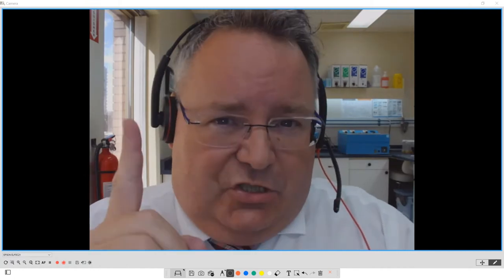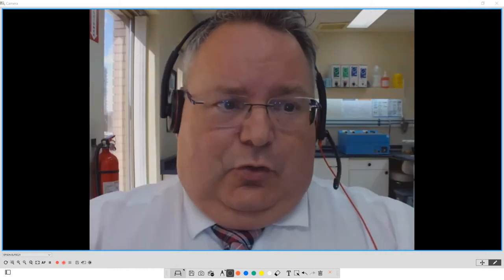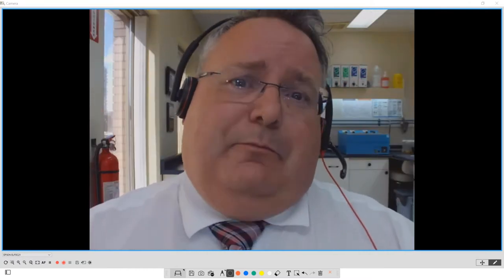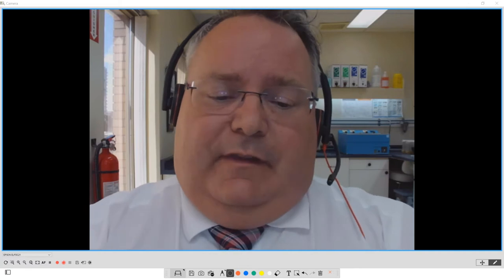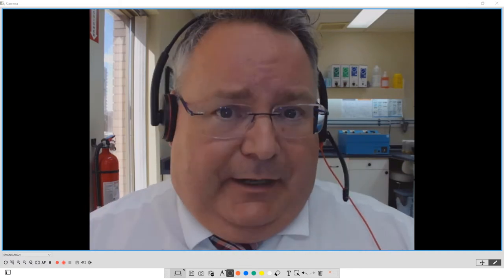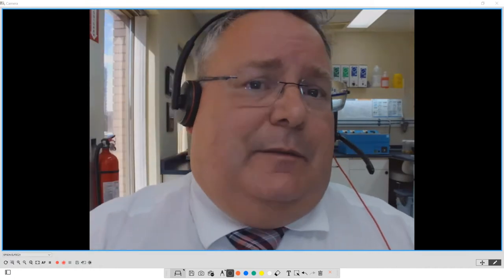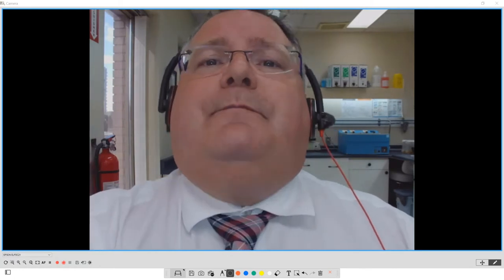Freedom. Challenge yourself. Now we've done model analysis, where I've gone through and pinpointed anatomical landmarks for that person based on the impression, and now I can identify where the teeth are going better for that person. More customized, less cookie cutter. It doesn't take me a lot of time to do that. It lets me be more accurate.